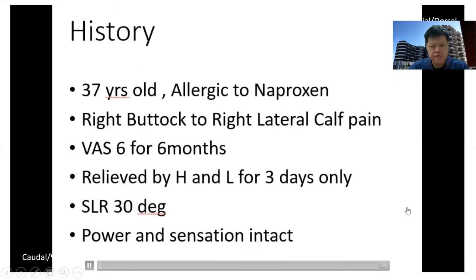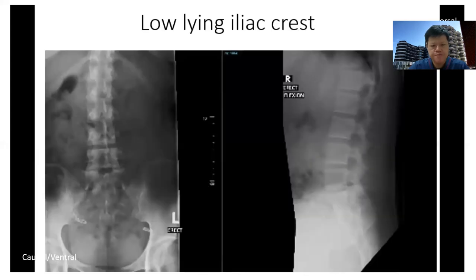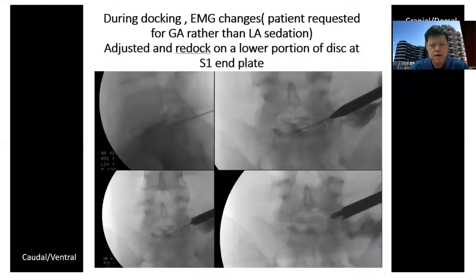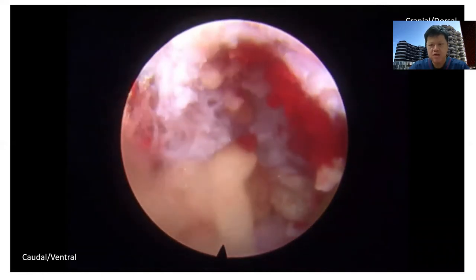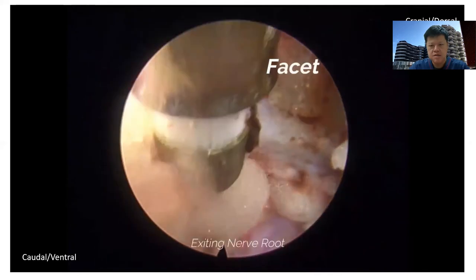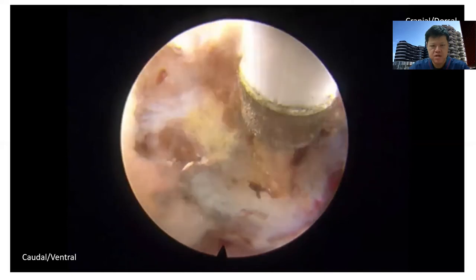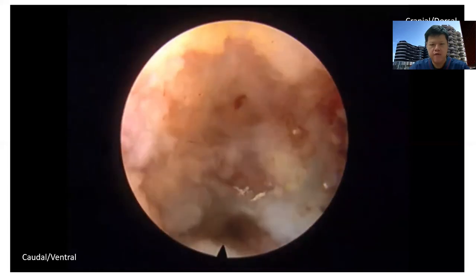To discuss the case of a right L5S1 mobile disc: a 37-year-old with right sciatica, straight leg raise of 30 degrees, and a foraminal disc in the right L5S1 region. She had pain relieved by selective nerve root block for only 3 days, then pain recurred with failed conservative treatment. I planned the trajectory as described and performed a transforaminal approach 8 cm from the midline. We first exposed the facet joint — the 9 o'clock position is caudal, 3 o'clock is the head, and 12 o'clock is the back — using radiofrequency ablation. Then we performed a foraminoplasty.